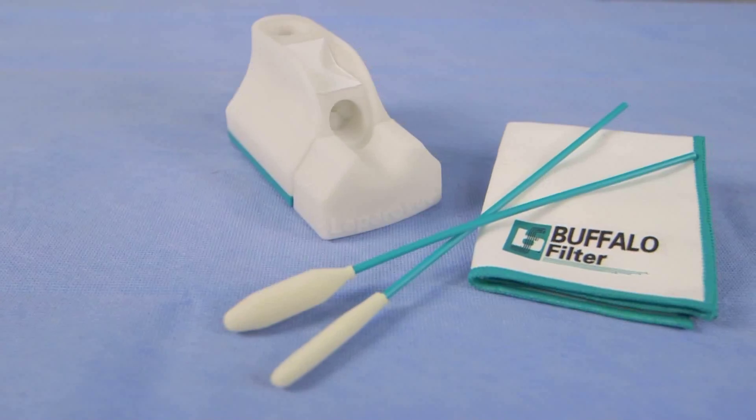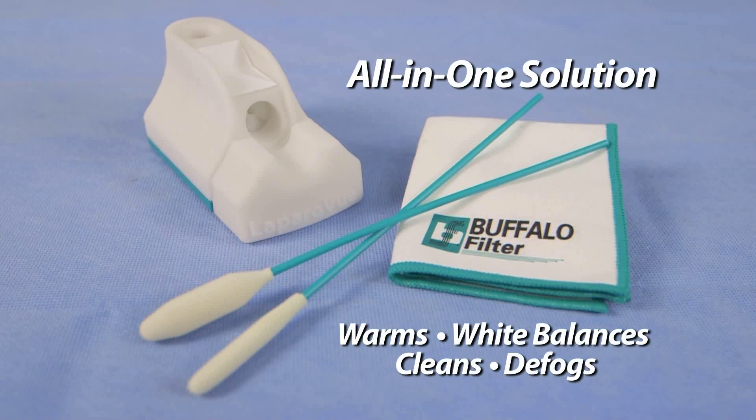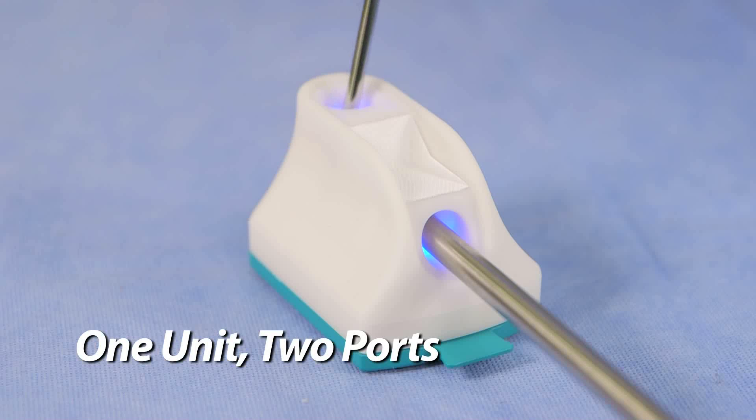An easy-to-use, disposable, multi-purpose device that warms, white balances, cleans, and defogs, LapraView eliminates the necessity for multiple product purchases. LapraView is distinctive in that it features two ports: one for warming and white balancing, and one for cleaning and defogging.